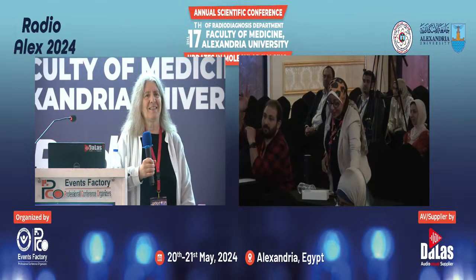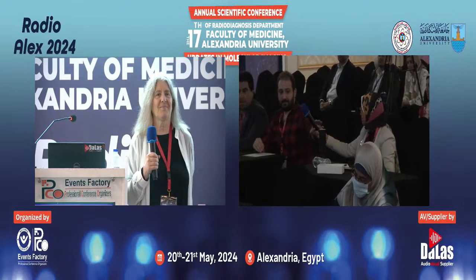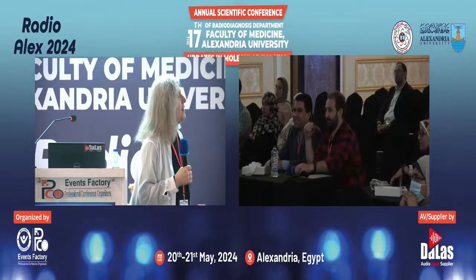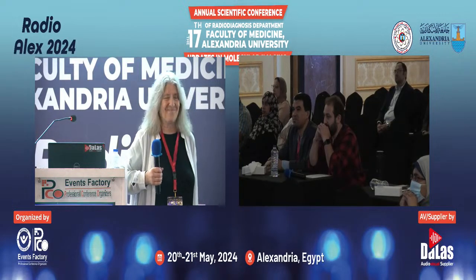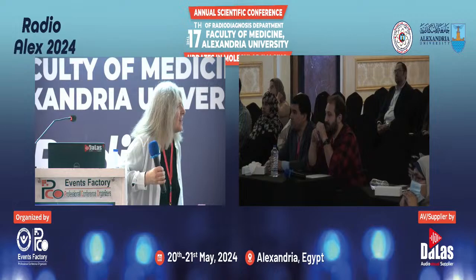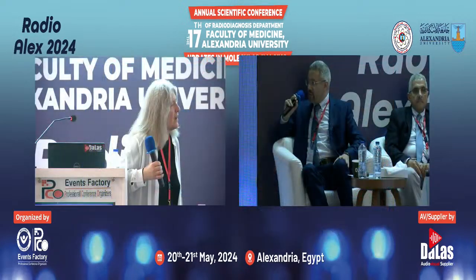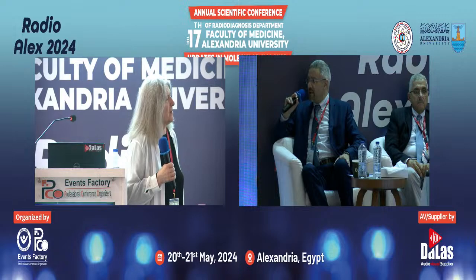Thank you. I have two last questions. First, regarding PET MRI, what will it add or replace PET CT in the future, and in which part of the body will it be preferred? The second question, my subspecialty is genitourinary imaging. I did research regarding post-RCC nephrectomy surveillance for metastasis using PET-CT, and we found a lot of deposits in strange sites. In the USA, it is recommended as a first-line surveillance post-operatively to assess metastasis in cases of surgically removed RCC or not.